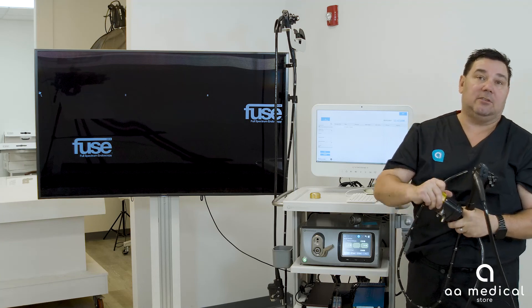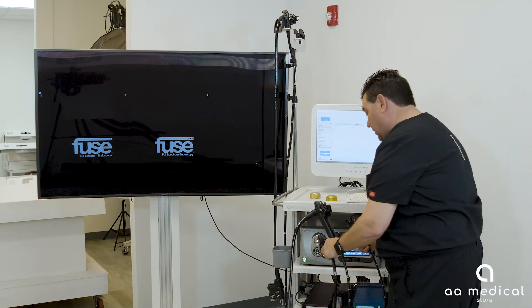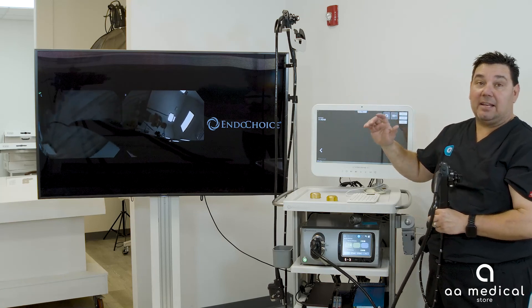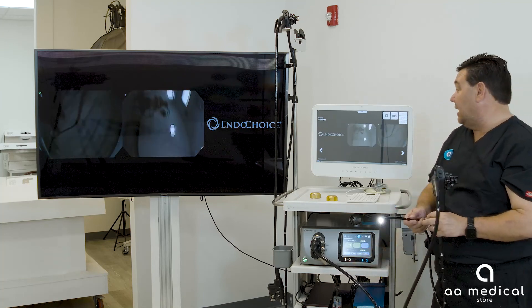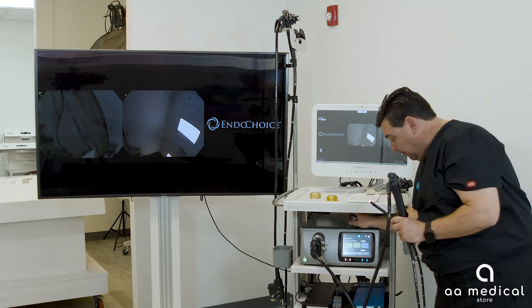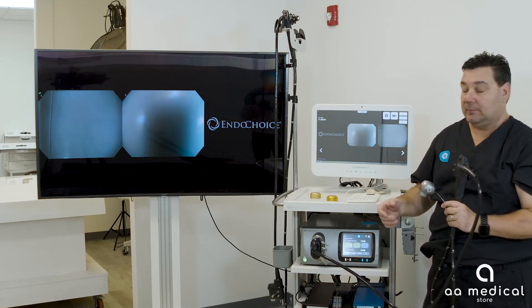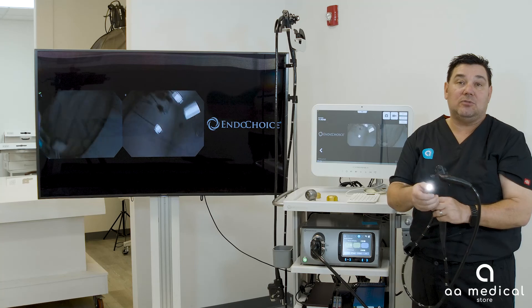To use the gastroscope, remove the protective cap from the scope, plug it into the system, and lock it down. The right side will be blacked out showing the EndoChoice logo, with the camera images on the left and center. You then do the same white balance procedure — place the white balance tool, hit white balance, and it calibrates the camera to ensure white is white. Once complete it changes to blue, then set it aside and the gastroscope is ready to use.